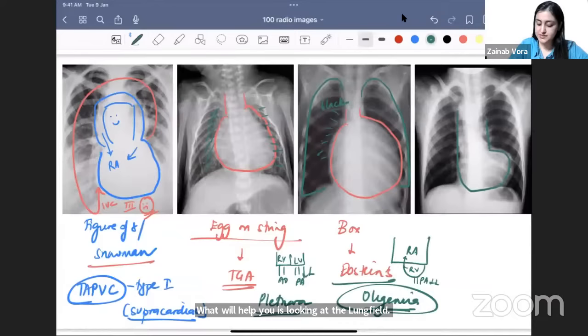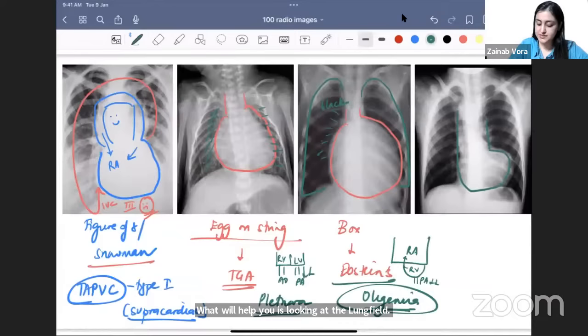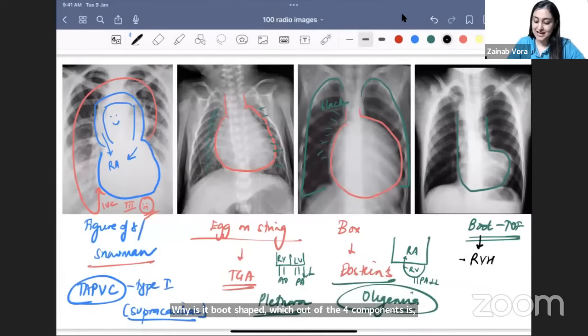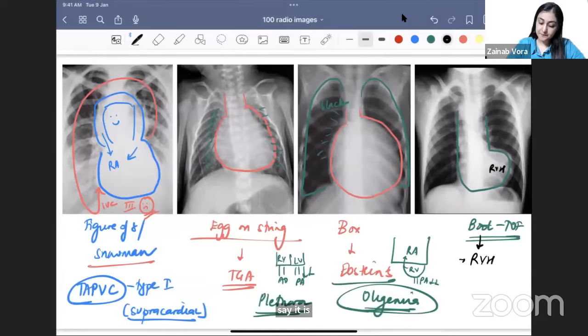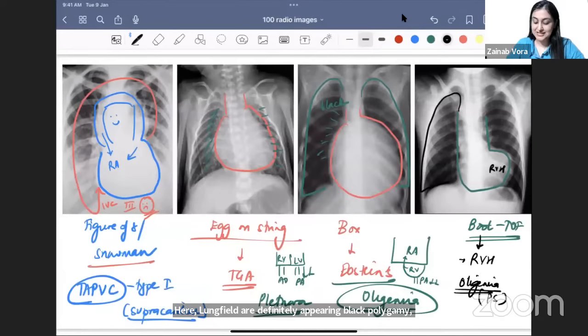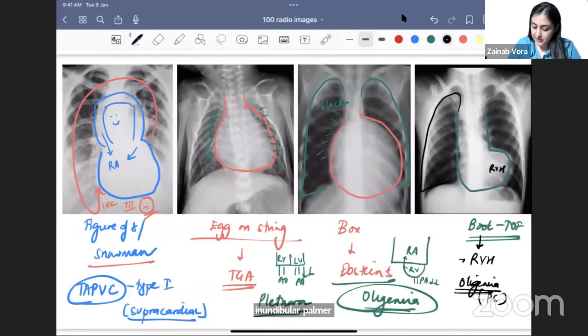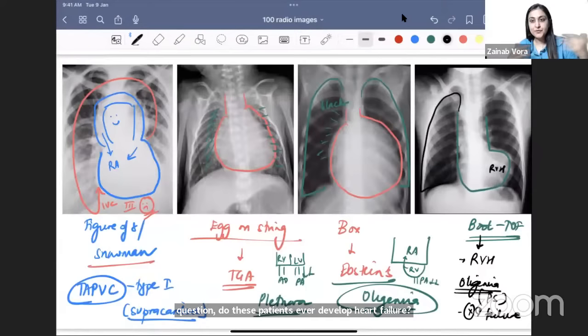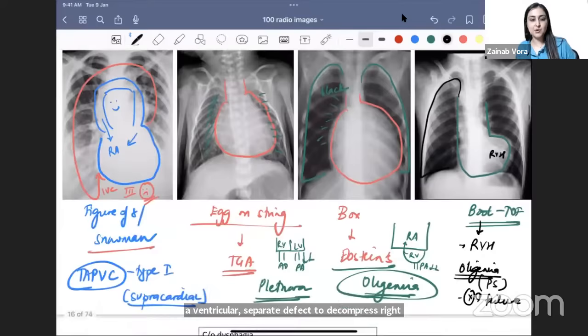Boot-shaped heart is seen in tetralogy of Fallot. It is boot-shaped due to right ventricular hypertrophy. Lung fields appear black — oligemia — because one of the four components is infundibular pulmonary stenosis, causing low pulmonary blood flow. These patients do not develop heart failure because the ventricular septal defect decompresses the right side. Tetralogy of Fallot is the most common cyanotic congenital heart disease.